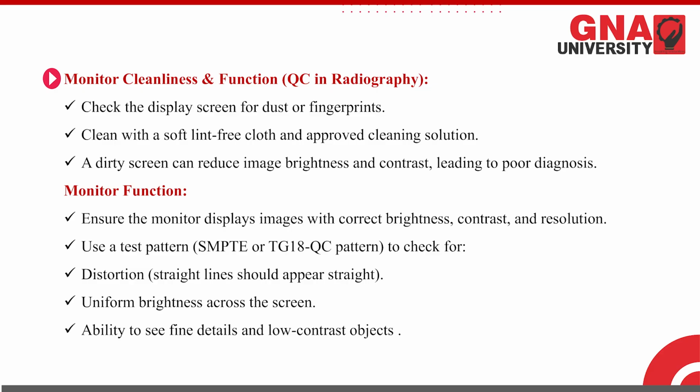Ensure the monitor displays the image with correct brightness. We have to ensure that it displays the image with correct brightness, correct contrast, and proper resolution. After that, we have to display a test pattern, the SMPTE or TG18 QC pattern, to check for any distortion and for uniformity.